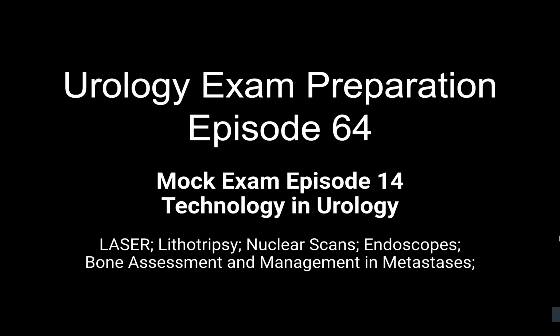The only drawback when compared to rigid is the image is not as great as the ones from rigid cystoscopy. Okay, why is the image not great compared to rigid cystoscopy? Because the flexible cystoscope is small in size.